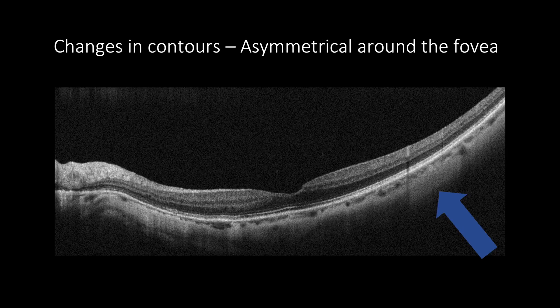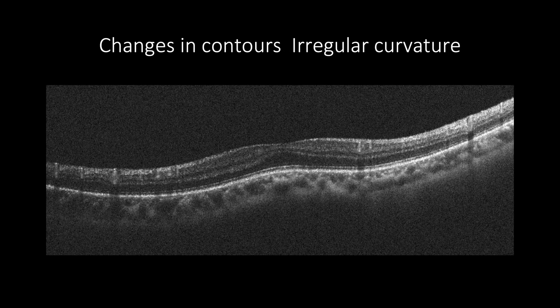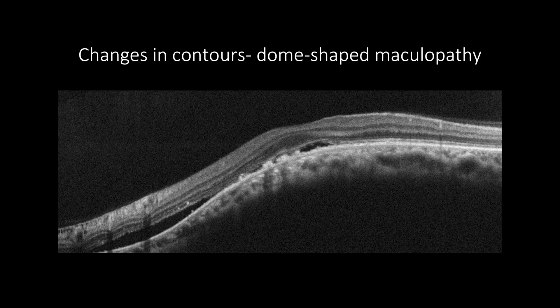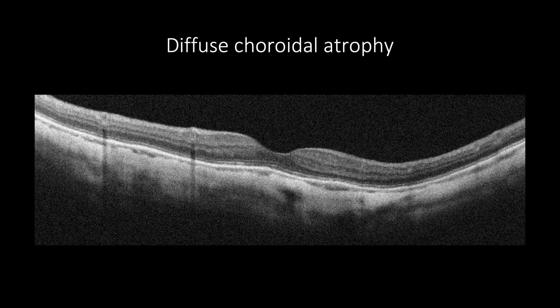Other patterns include asymmetrical curvature around the fovea or irregular curvature. Rarely, the macula looks convex, creating dome-shaped myopic maculopathy, which may be associated with subretinal hypo-reflective spaces. In diffuse chorio-retinal atrophy, the choroid is thinned and may have only a large choroidal vessel remaining under the RPE.